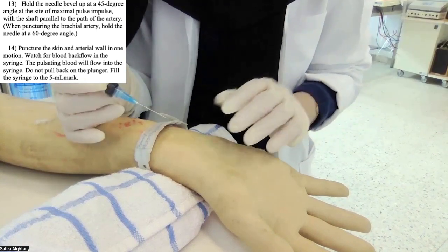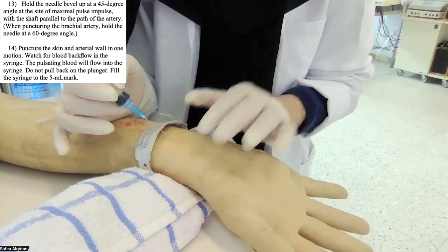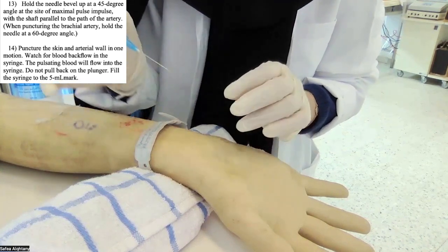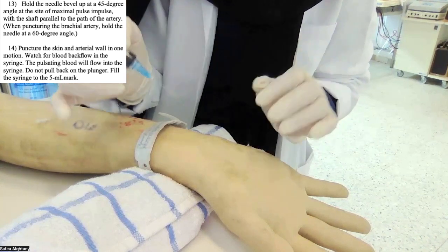Then I need to insert or penetrate the skin and the artery in one motion. يعني إيش one motion؟ يعني ما أتردد في إني أدخل السرنجة، أحاول إن تكون حركتي واحدة في طريق واحد in one motion.